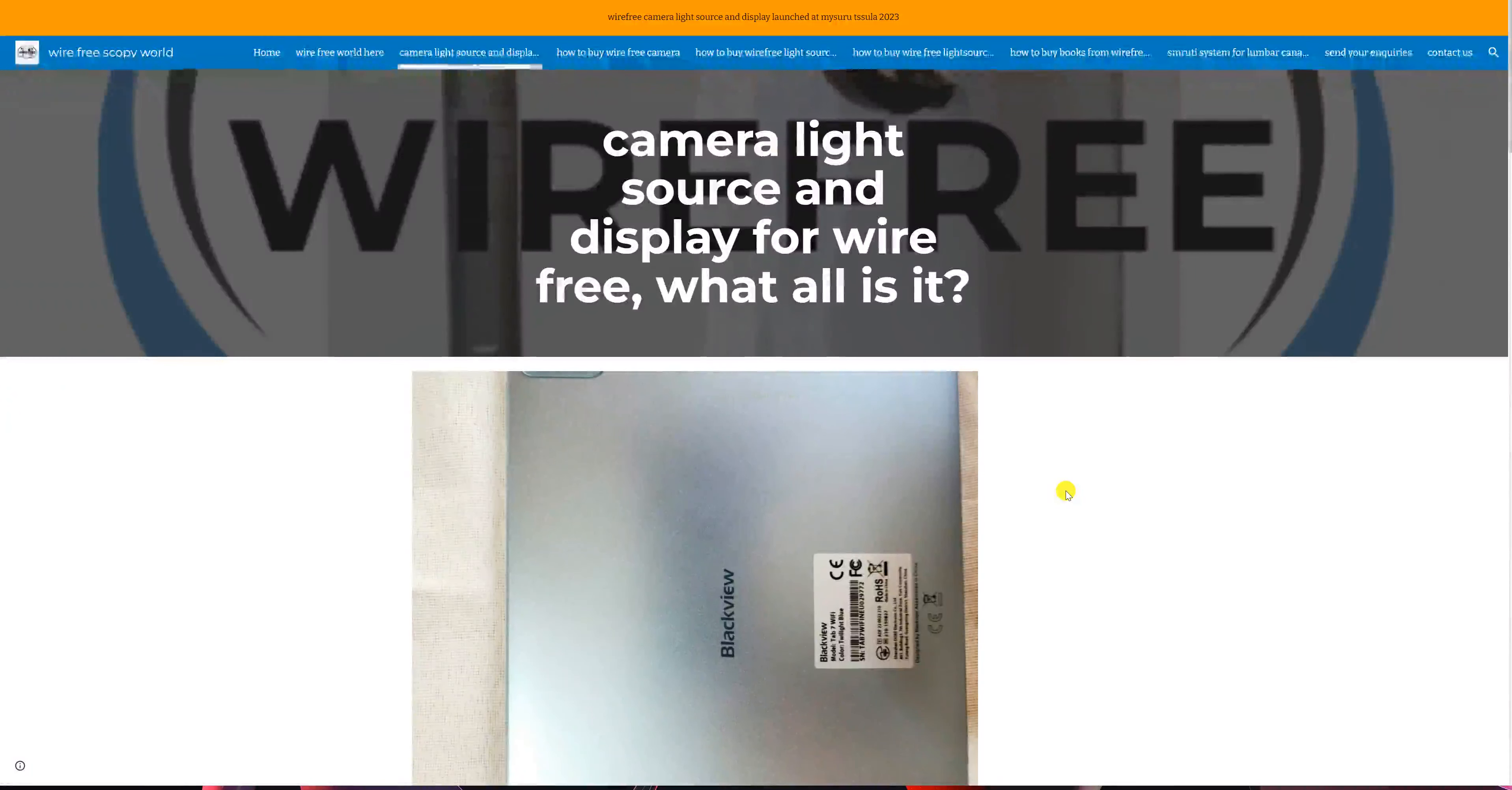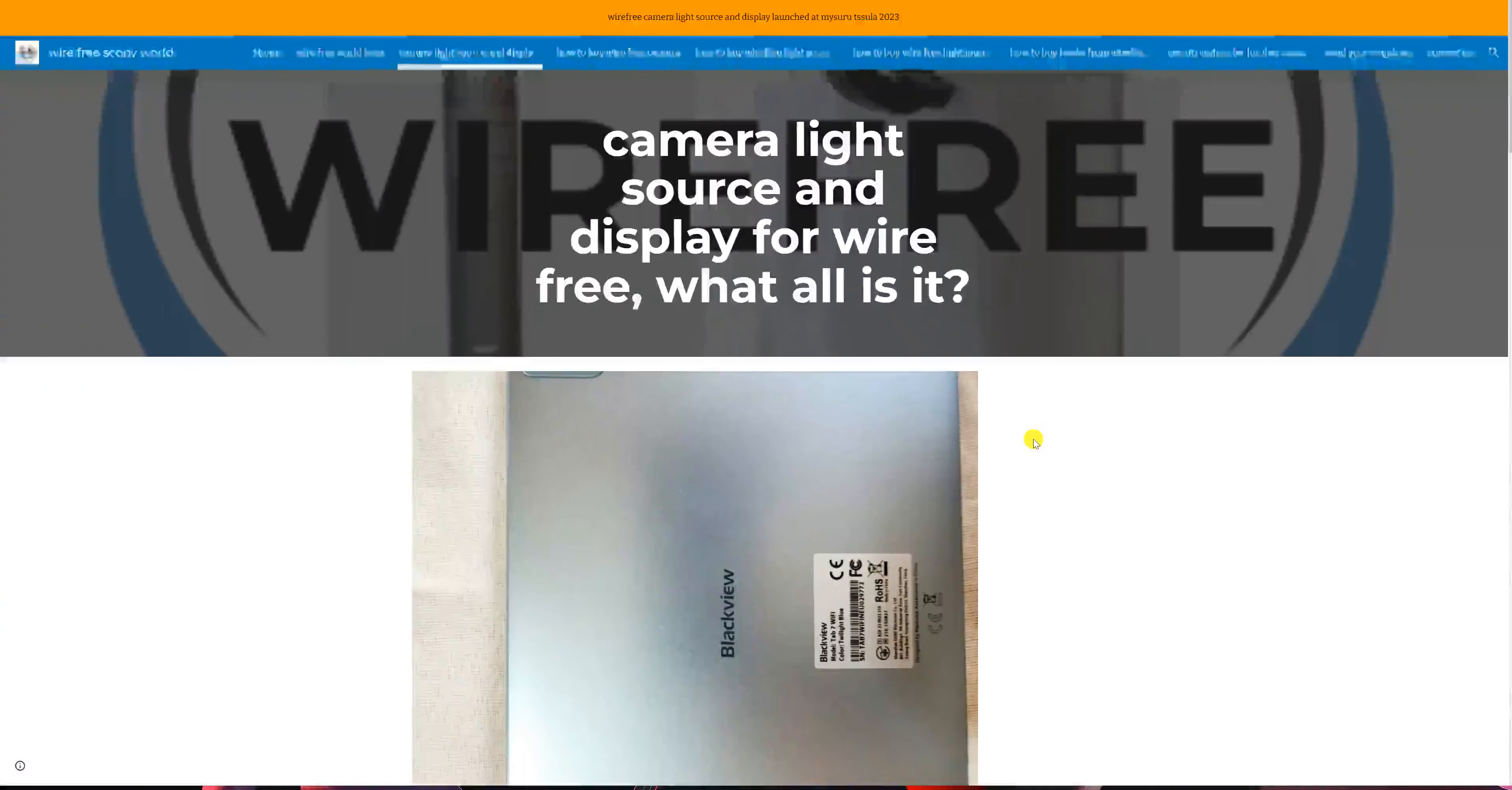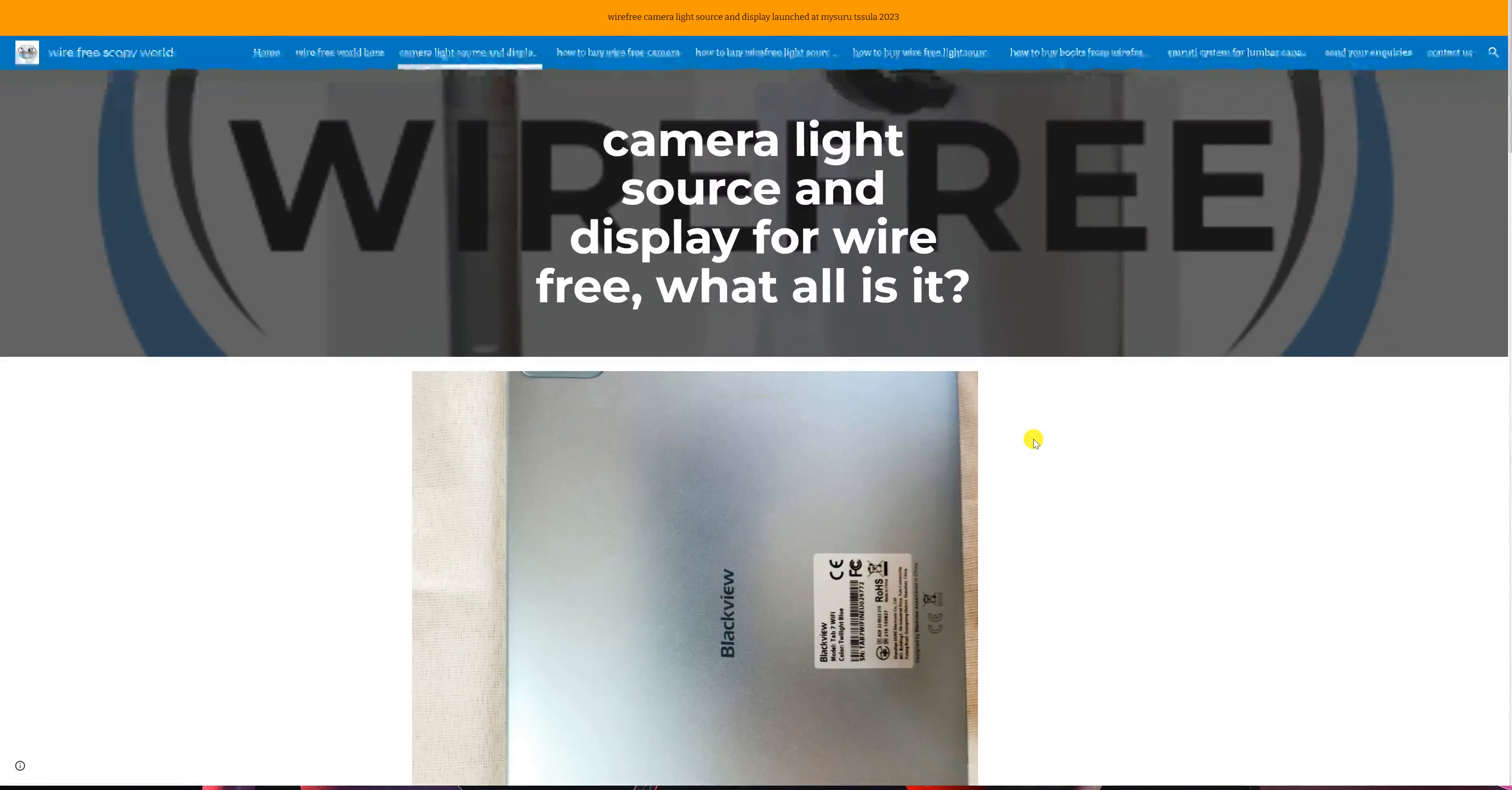Welcome to the contents of our magic bag which will take you to the wire-free world of Scope. It contains the camera, the light source, and the display.